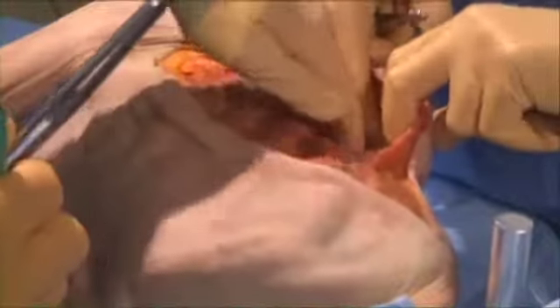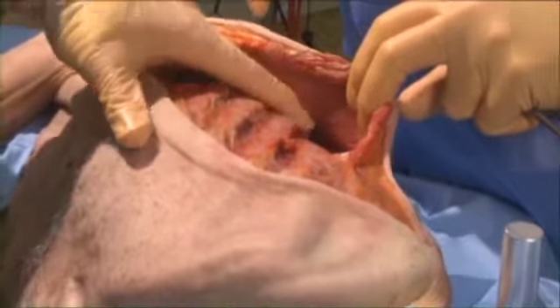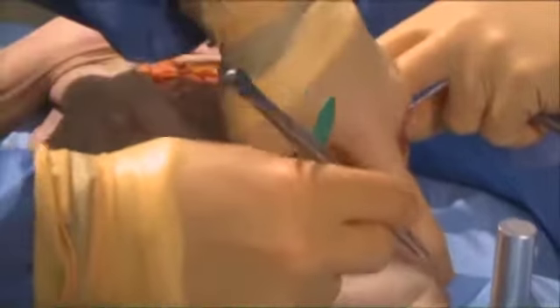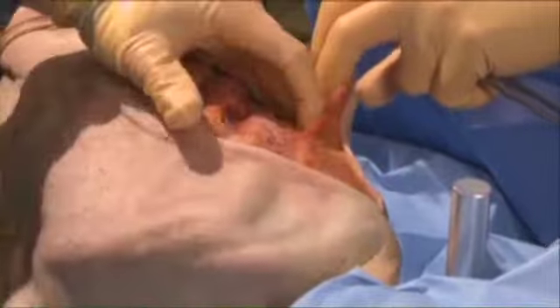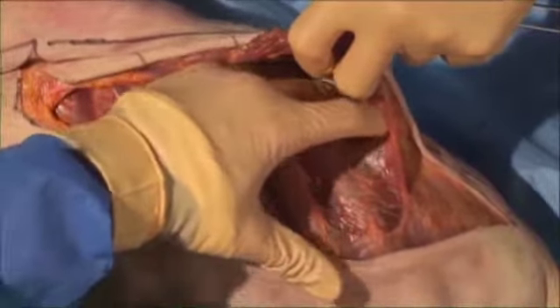And then once you have the plane, then you can slip down behind it easily. And once you slip down behind it, you can get all the way around to the back without doing a tremendous amount of muscle damage. You can work more distally this way to get to the most inferior rib, continuing to lift the slips off and then some of the latissimus distally.